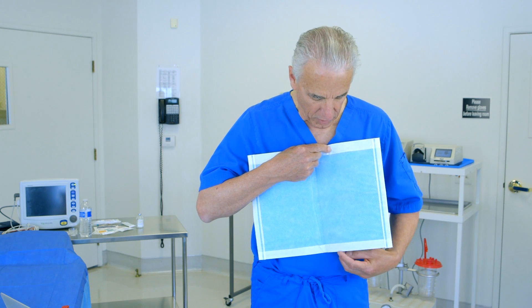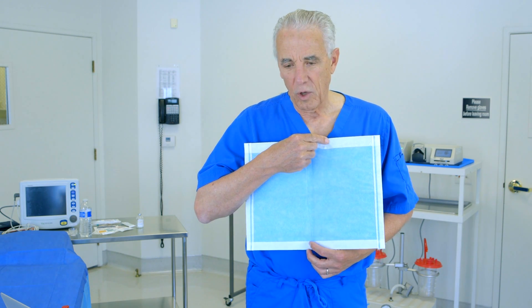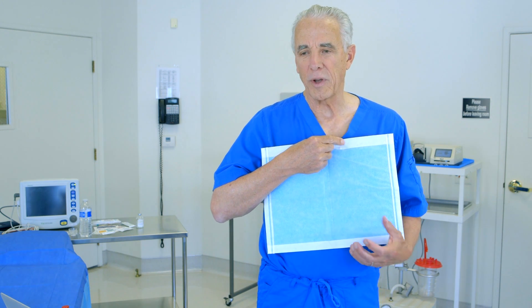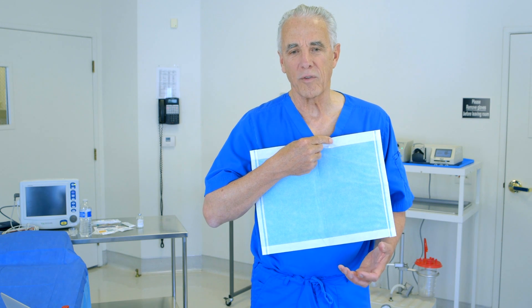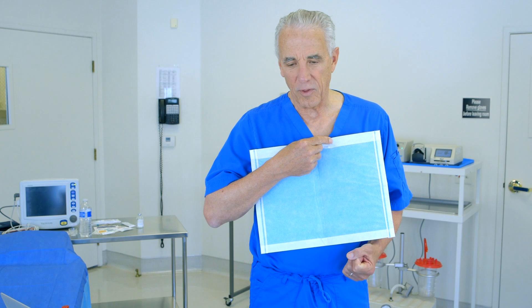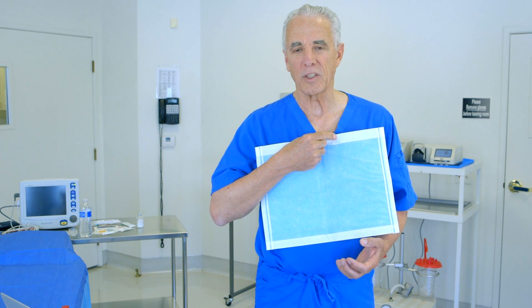This prevents dripping and draining outside of the pad. It is very effective. Because tumescent local anesthesia and liposuction create an abundant volume of post-liposuction drainage, we would like to collect that as efficiently as possible.